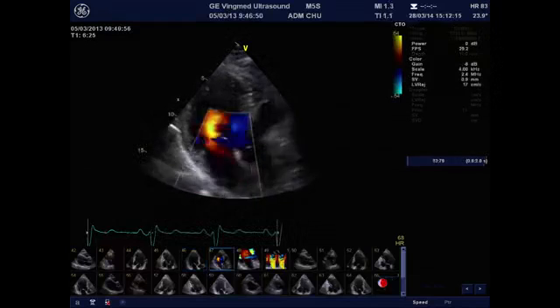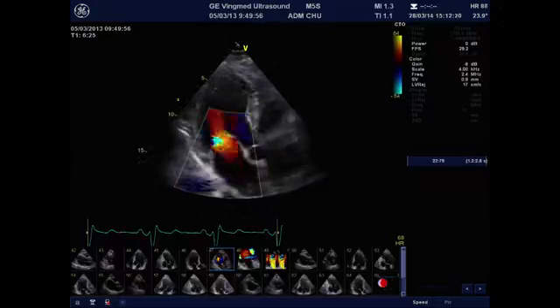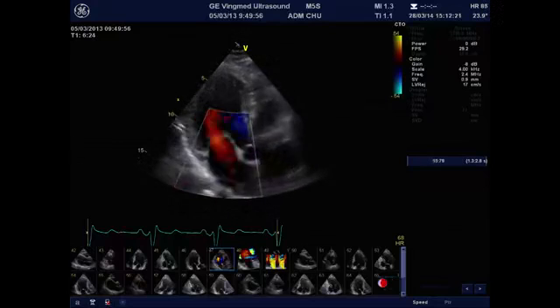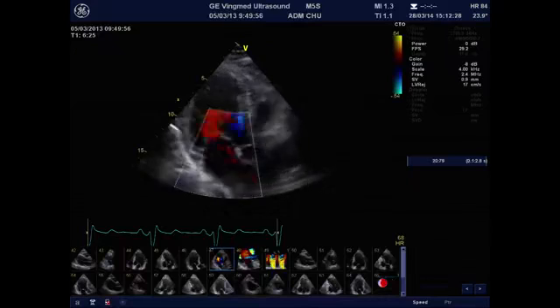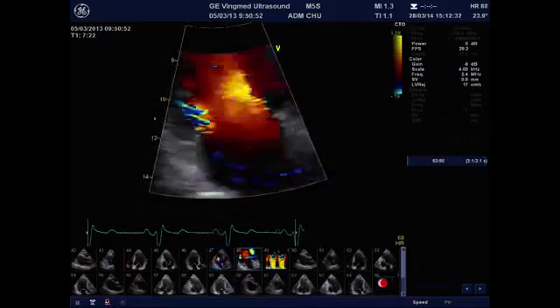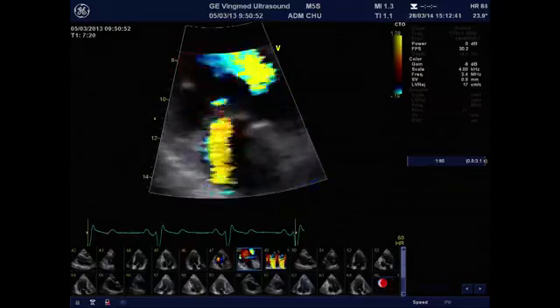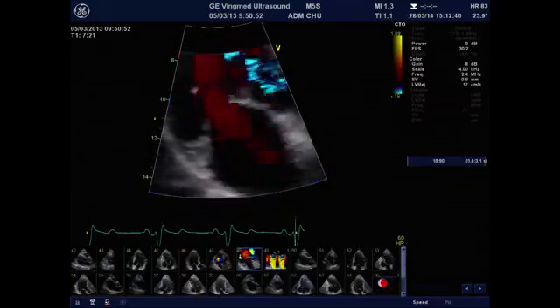There is indeed a mitral regurgitant jet from the left ventricle to the left atrium, which should not be quantified according to the area of regurgitant flow in the left atrium because of several technical and physical factors. We can try to obtain the convergence region. While it's rather difficult, if there is a PISA, it's certainly very small.